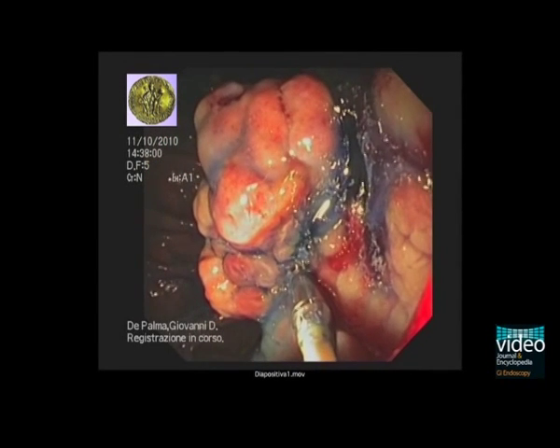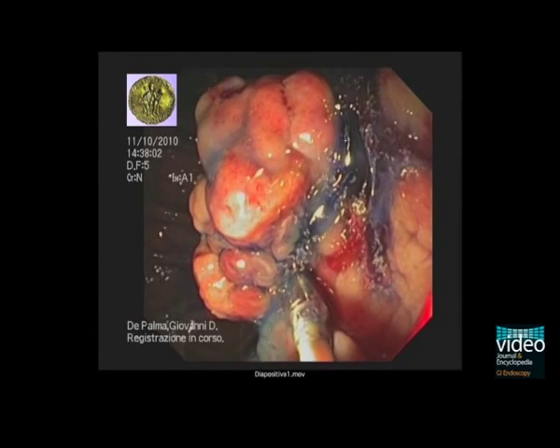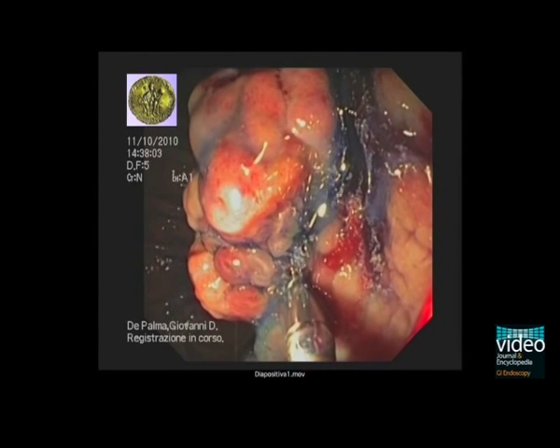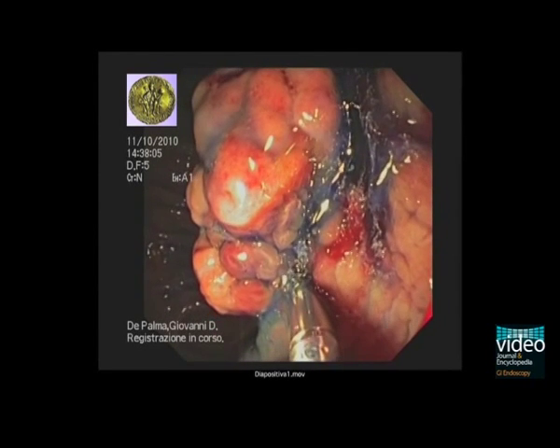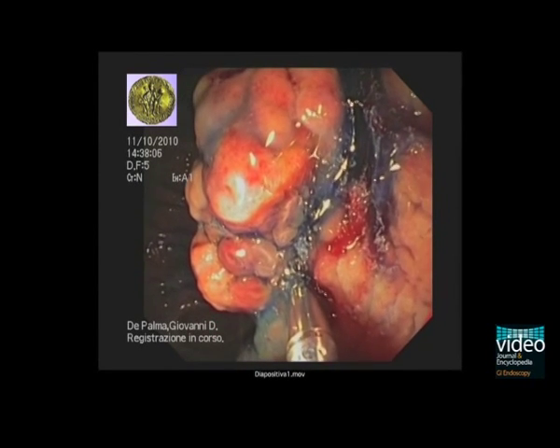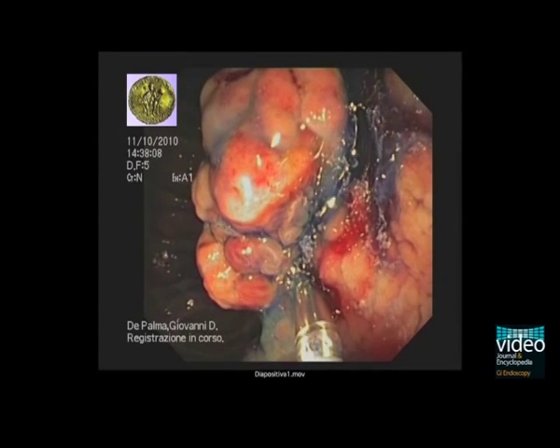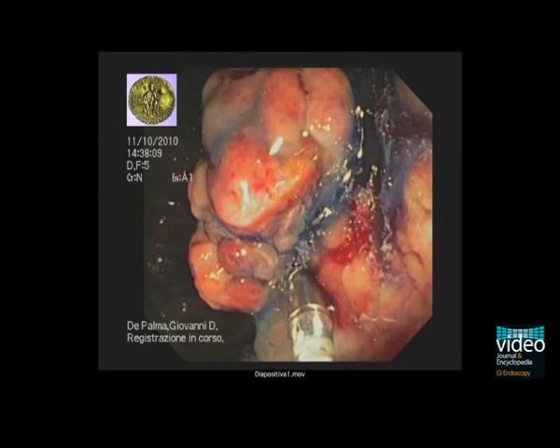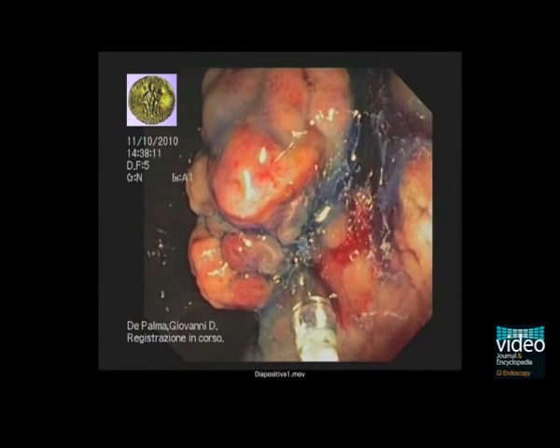5 millilitres of 10% sodium fluorescein are injected intravenously. The tip of the probe is placed in direct contact with the target tissue site of both the mass and surrounding rectal mucosa.